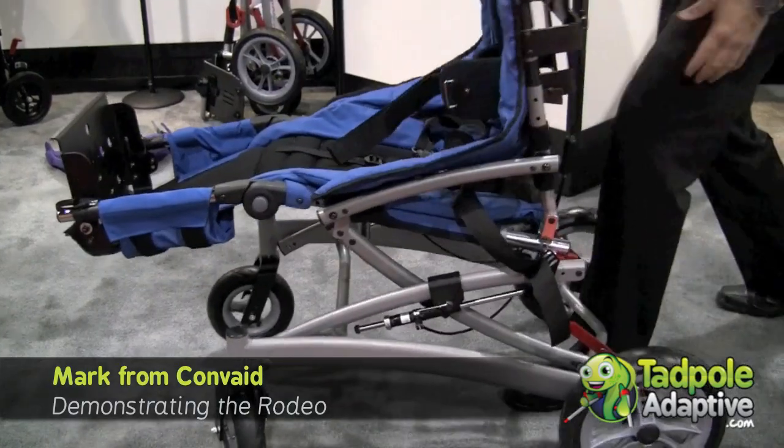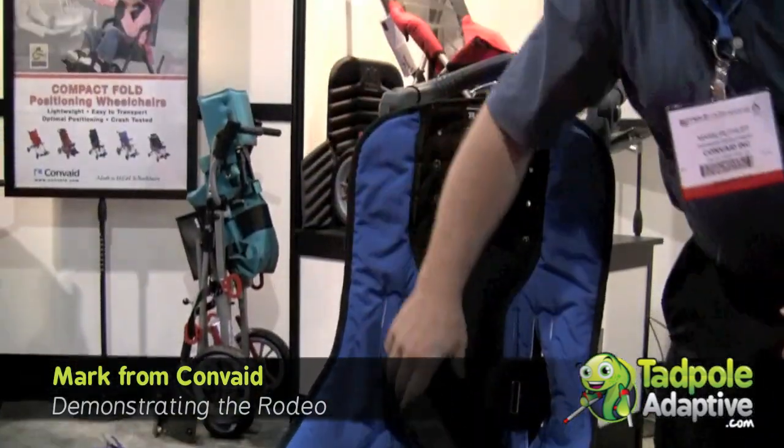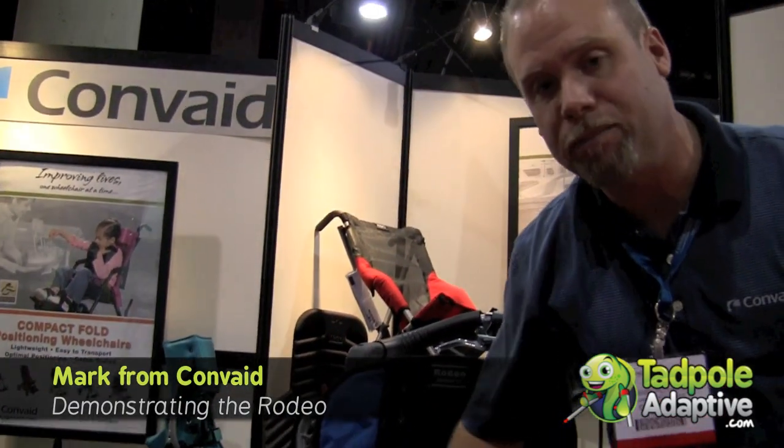It's a very easy to use package, and a terrific tilt-in-space wheelchair that's light and easy to handle. It fits in almost any car's trunk. That is the Convaid Rodeo.